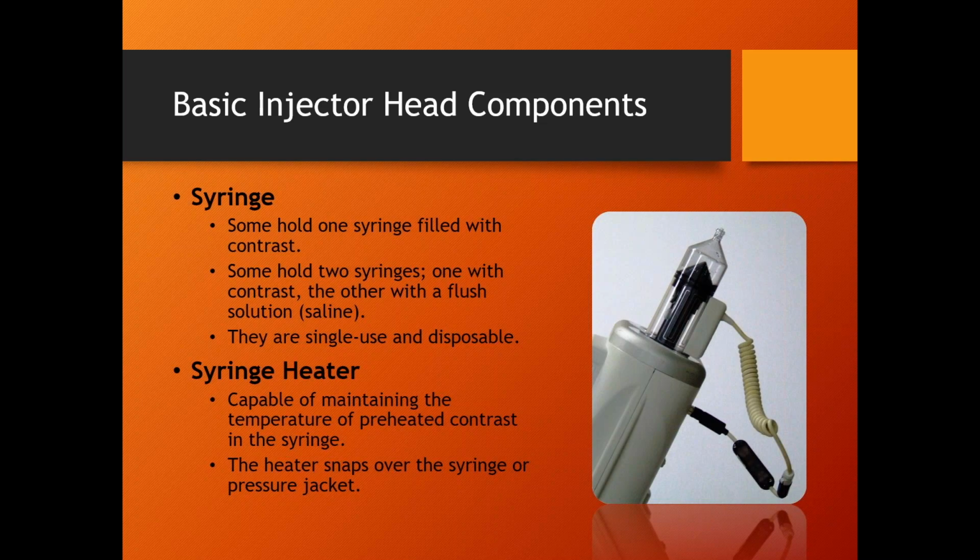So that's what these are. These are just heaters you plug in. They're set to 37 degrees Celsius, which is 98 degrees Fahrenheit, body temperature. They're basically digital. They work or they don't work. There aren't adjustments for them. When they break, you throw them away, and they're freakishly expensive. This piece, the wire with the plastic and the hard cover right here.